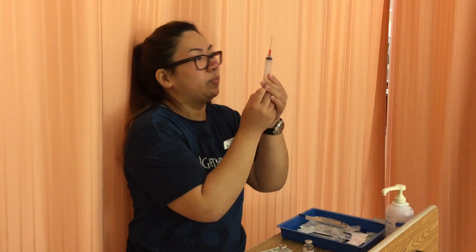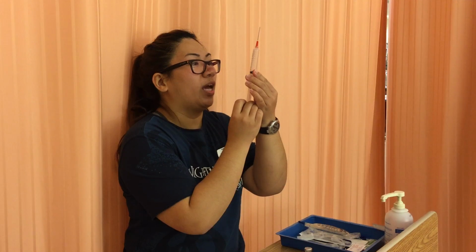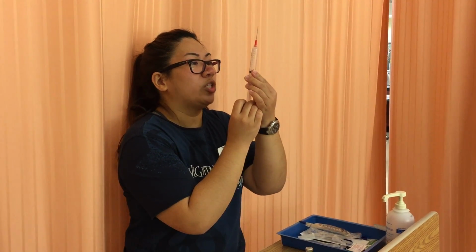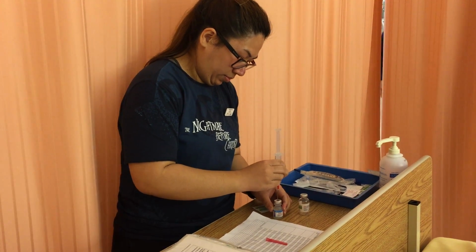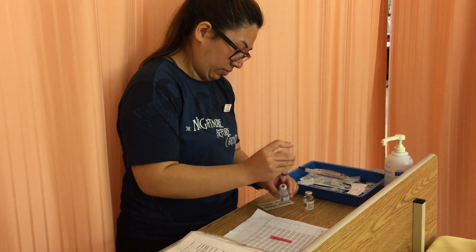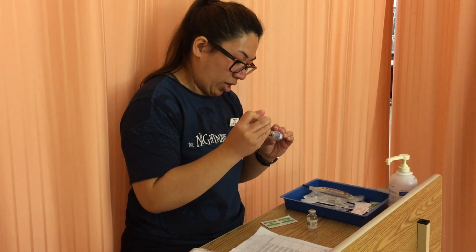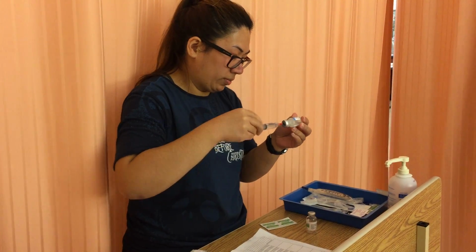Now, because we're needing 10 ml of sterile water, we have to draw up about 10 ml of air to give a little bit of pressure. And let the plunger go up on its own so it won't be that hard to get our sterile water.